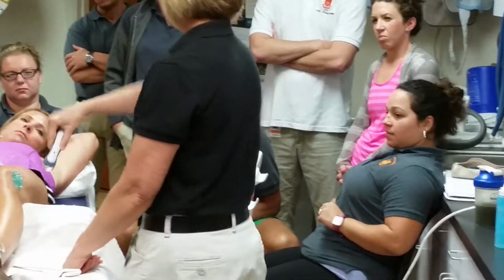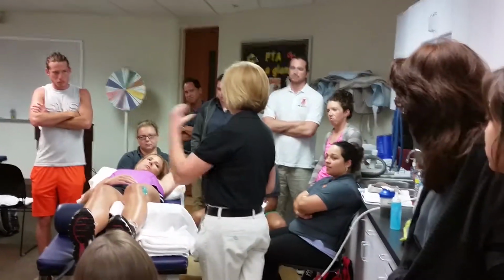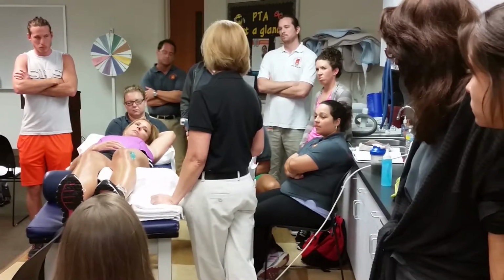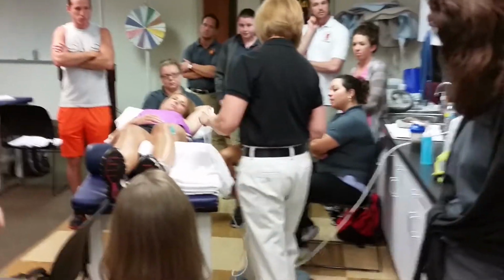So you'll see a lot of therapists scoop with the sound head. Don't do that. Just squirt more in the area, or use your tongue depressor and move it into the area, okay? Because you're changing the delivery of the sound waves.